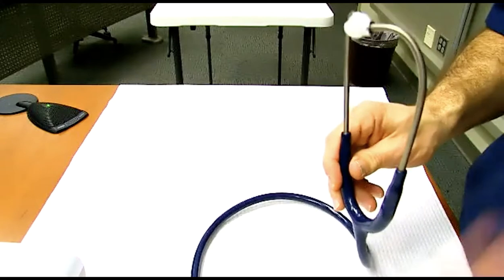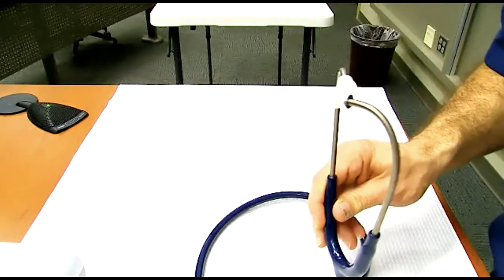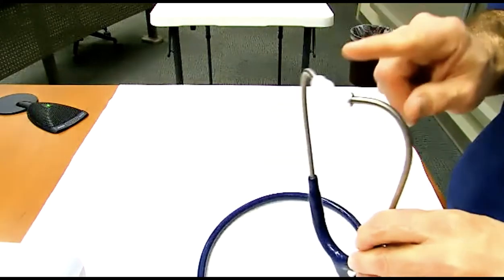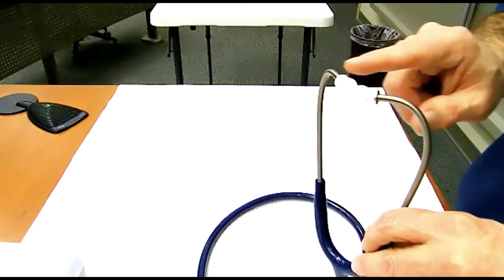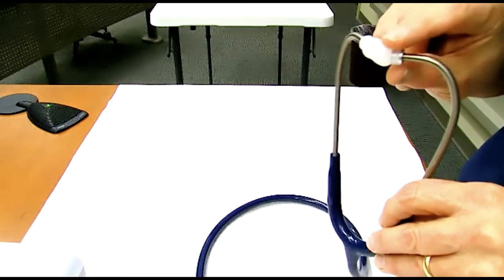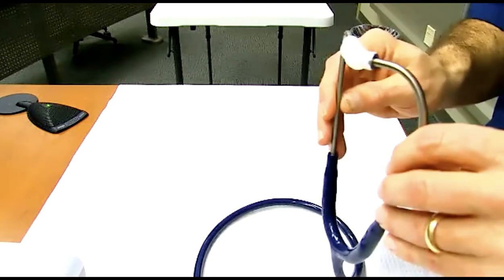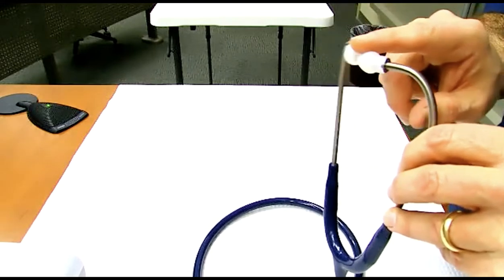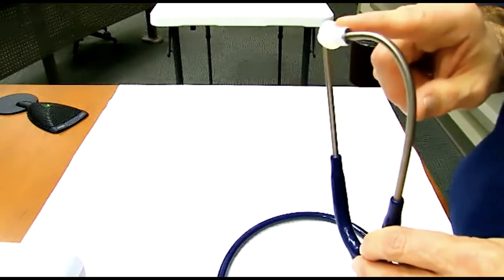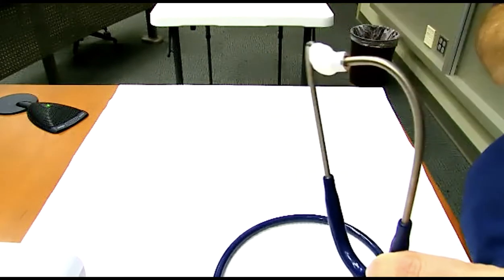We're going to talk about, there are three things. But to be honest with you, the hardest part about blood pressure is that the sound that you're listening for is really soft. It's a little ta, ta, ta, ta. And again, sometimes it's hard to hear. One of the three things that we can try to make sure you maximize your chances to hear it is to change these to maybe a smaller size. Because if these are too big for your ear, then they won't sit inside the ear far enough and you won't be able to hear very well. Most people, these work fine, so I'd leave them on there for now. But if you're having problems hearing it and the volume just is barely audible, then that's one of the things we can try to do, is to change those earpieces. So don't lose those other earpieces. It may be something for you to actually try.